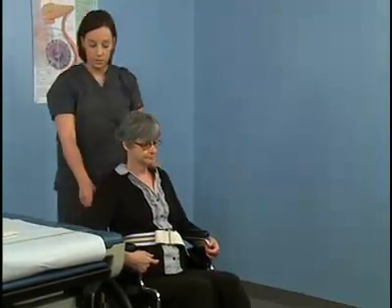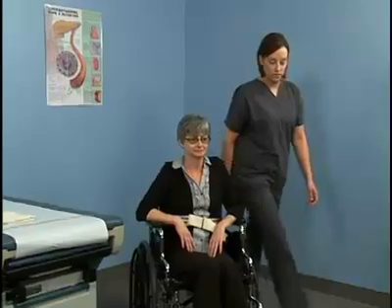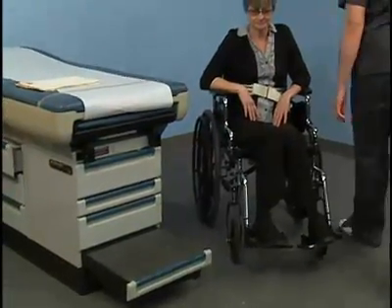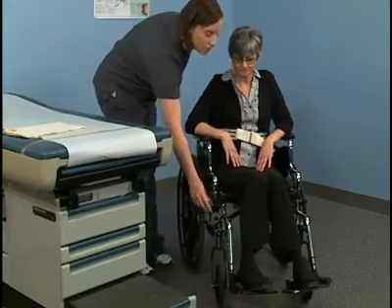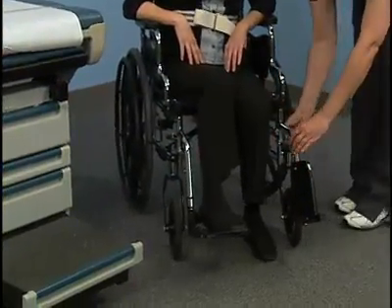With the patient's stronger side next to the examining table, position the wheelchair at a 45-degree angle to the end of the examining table. If the table is height adjustable, adjust it to the same height as the wheelchair or slightly lower. If the table is not height adjustable, such as the one you see here, pull out the table's footrest. Lock the brakes of the wheelchair to prevent it from moving during transfer. And fold back the footrests to clear the path for making the transfer.